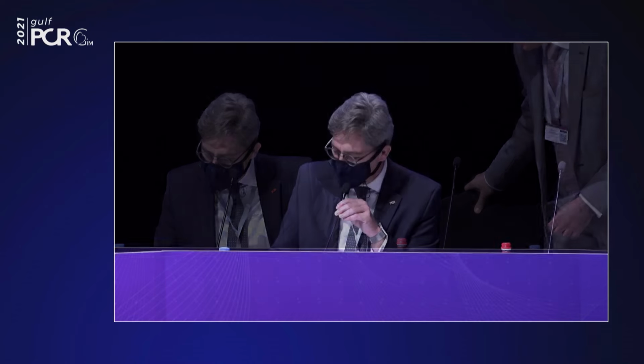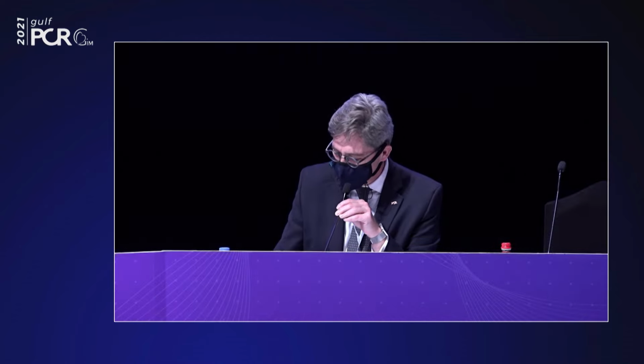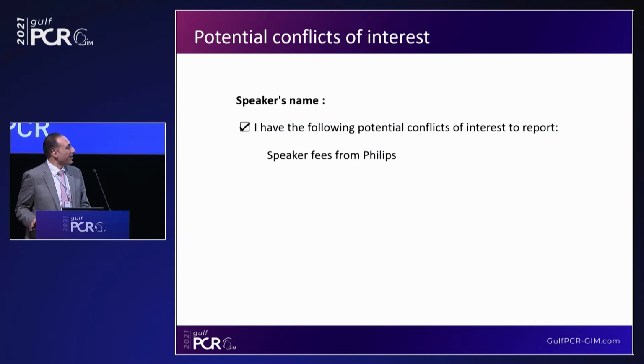That was a great introduction and setting the stage. Ahmed Khashaba, ultra-low contrast tools and techniques in the cath lab. Yes. We see the tools first, then we see the cases. You're absolutely right.